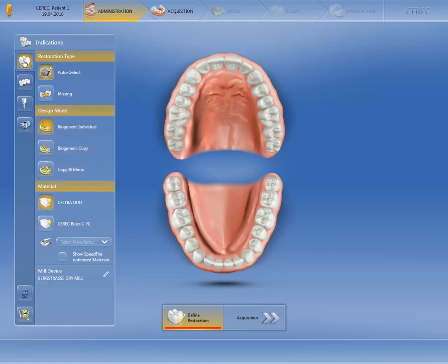In the section under Material, there is always the last selected material displayed. Of course, you can also change it using the drop-down menu. This procedure in the indications window is also similar for other indication types.